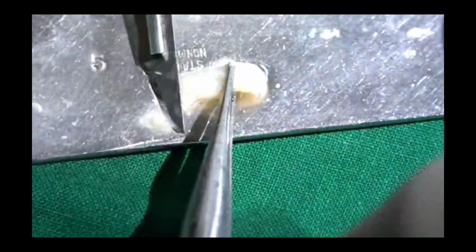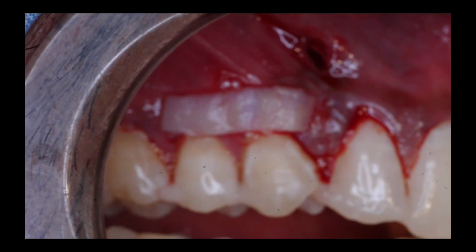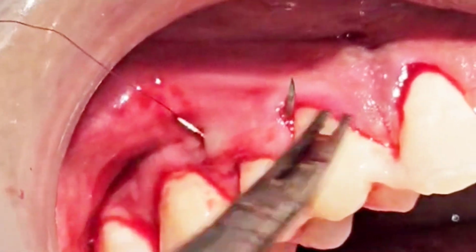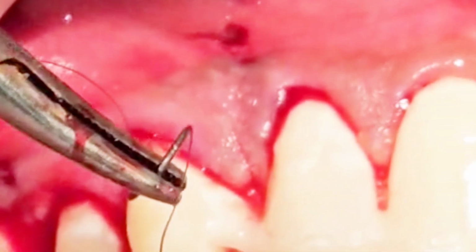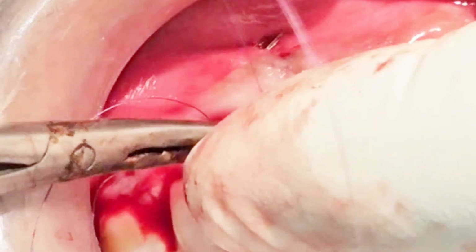After the CTG is ready, we need to confirm the extent of the CTG. So it's placed on top, and now we are planning to get the CTG inside the tunnel and place the CTG over the premolars.